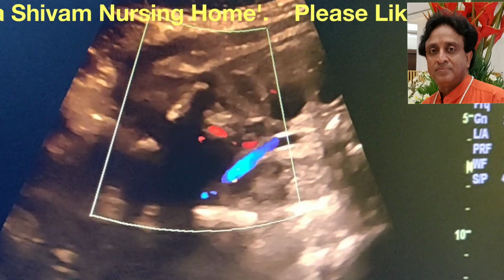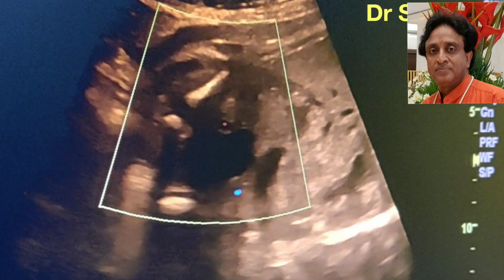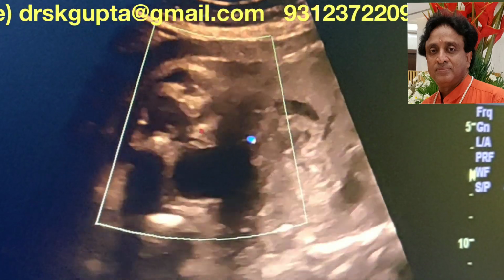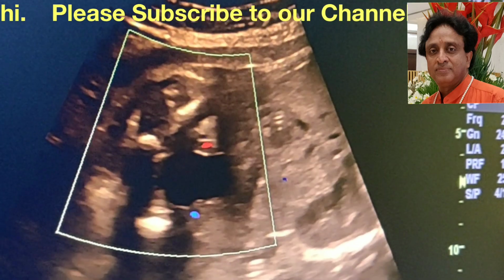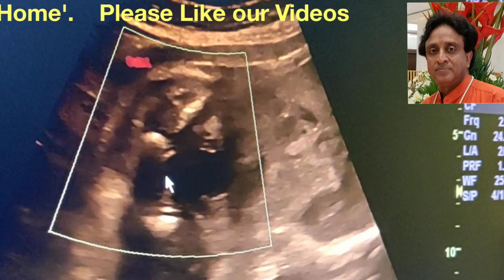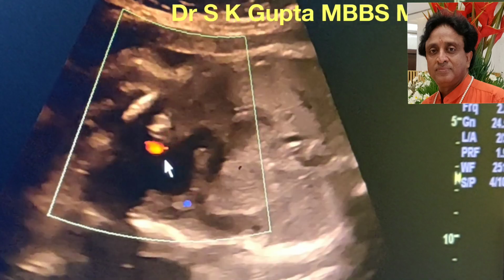And now this is the bladder. You can see the fetal urinary bladder. The cause of the unilateral hydronephrosis in the fetus is either vesicoureteric reflux or PUJ obstruction. Knowing what the cause is is beyond the scope of this scan. If you see any keyhole appearance here, it might be indicative of proximal urethral obstruction, like posterior urethral valves or some other pathology. But because it is unilateral, the pathology has to be there.